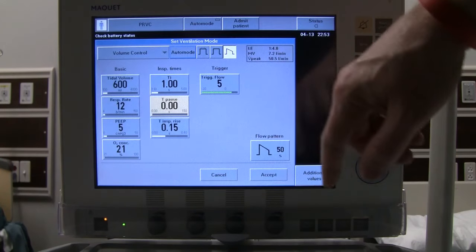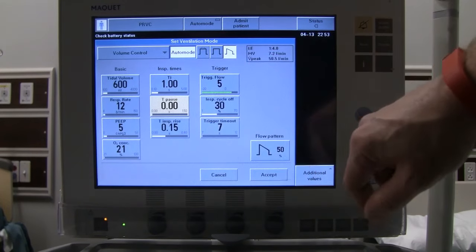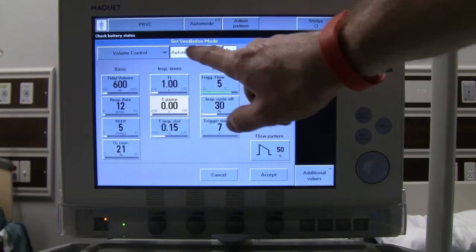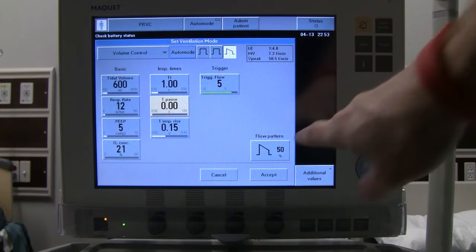We'll go ahead and use the descending waveform. If you use auto mode, it gives extra options including an inspiratory cycle-off percentage and a trigger timeout — if the patient isn't triggering within a set time, the ventilator delivers controlled breaths. We'll take it out of auto mode and accept our initial settings. We're now looking at the setup screen but the ventilator has not started ventilating yet.